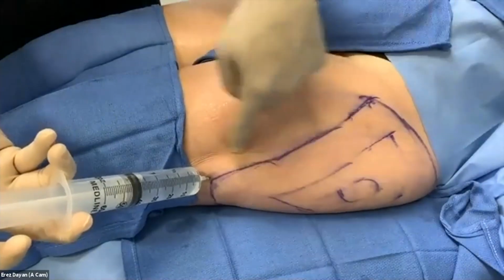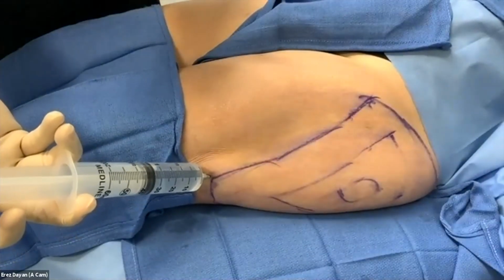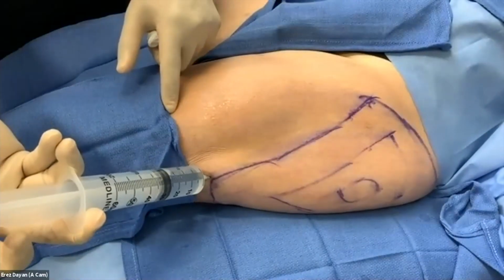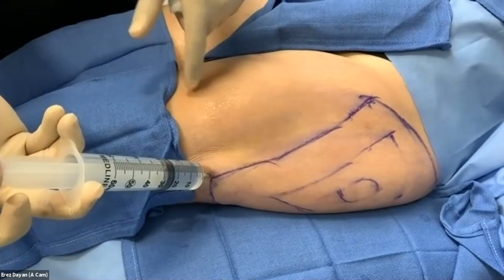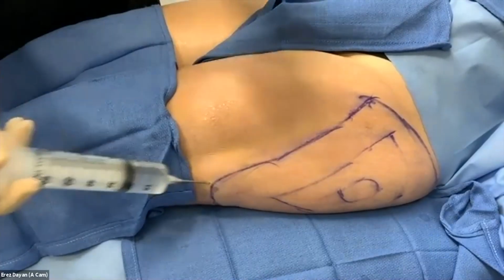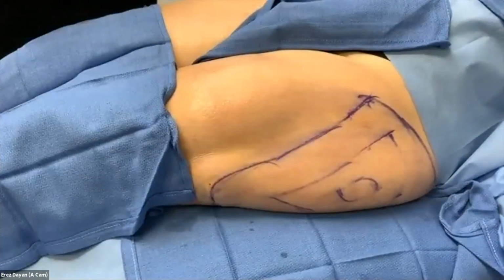So now I have an area of local, and this is kind of what gets me in. The goal is small areas and kind of move forward so the patient doesn't feel any pain. So I'm just going to get a nice wheel here. Now this is developing my plane. I know I'm right above the fascia, and that's where I want to be, because I just want to treat the soft tissue as a whole. In many ways, this is actually safer in the sense that if you hit fascia, the patient's going to tell you.